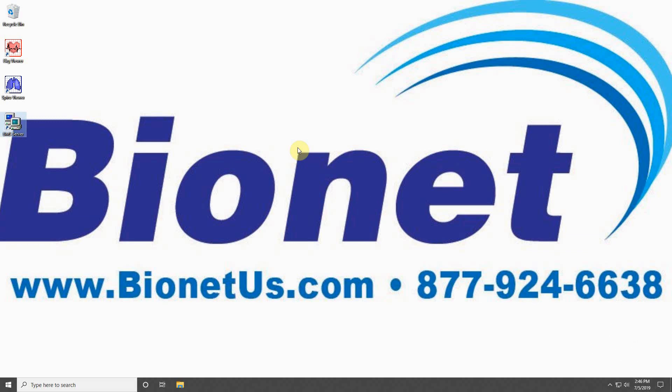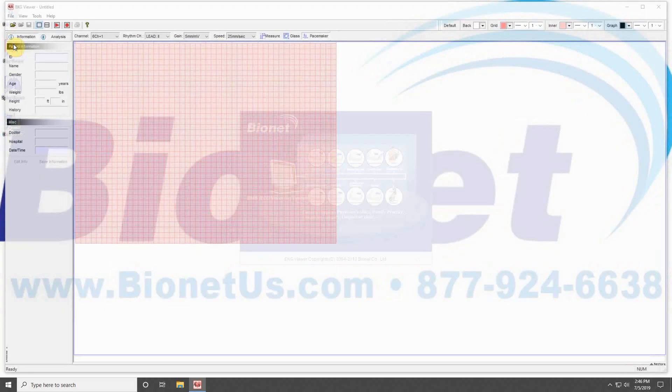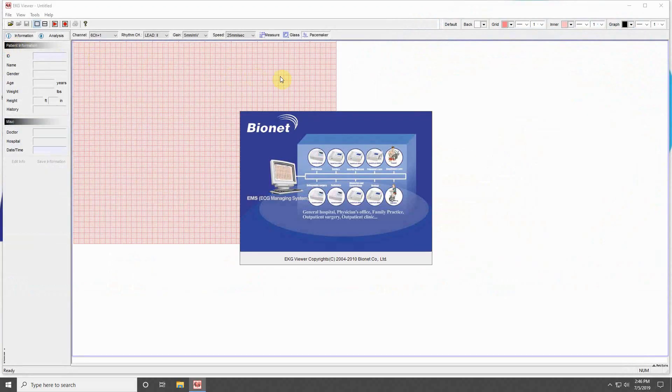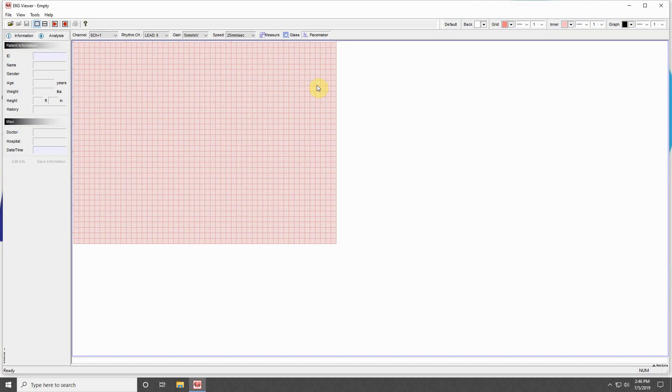The next program we will cover in BMS Plus is the EKG Viewer program. Launch this program by double-clicking on the desktop icon or launching from the BMS Server list. This is the main screen for the EKG Viewer. Let's take a tour of the program.